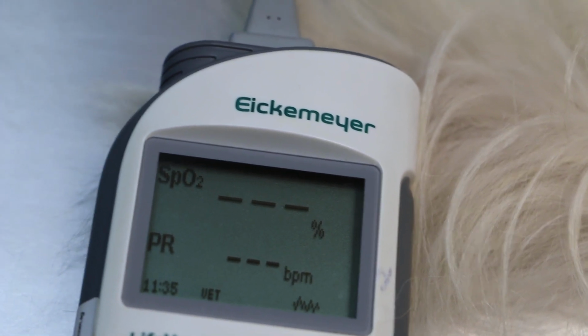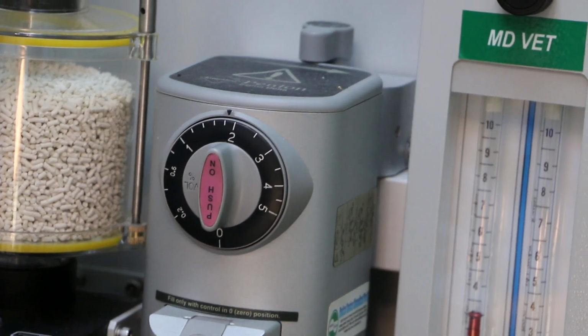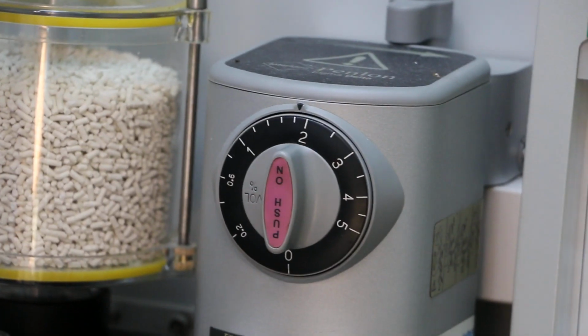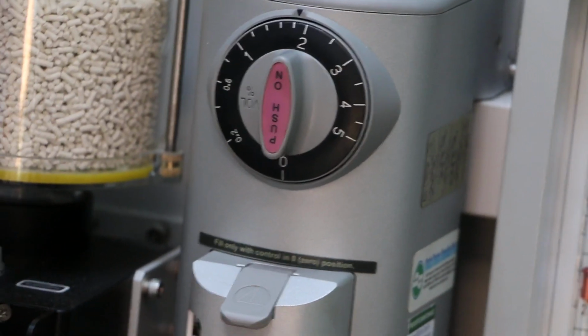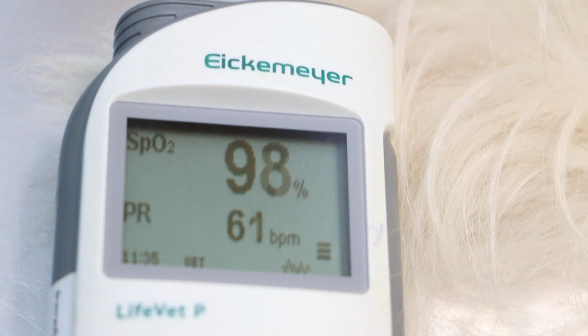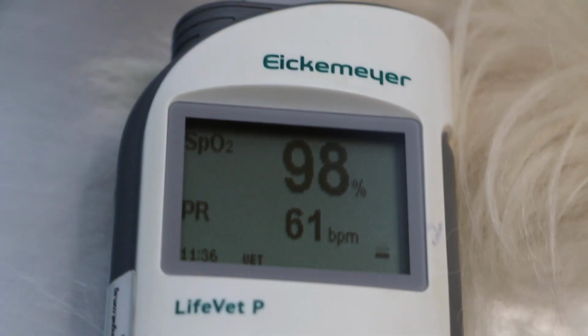Then we just turn over to the left hand side. So let's see the oxygen, the isoflurane by right should be 2%. It's more than enough, which we are doing now. And so the lowest dose is the safest dose. Sometimes I can do 1% for very old dogs as well. So it's not necessary to put 3%. Now 95 is okay, 97 is better. Yeah. Okay, we finish the front.